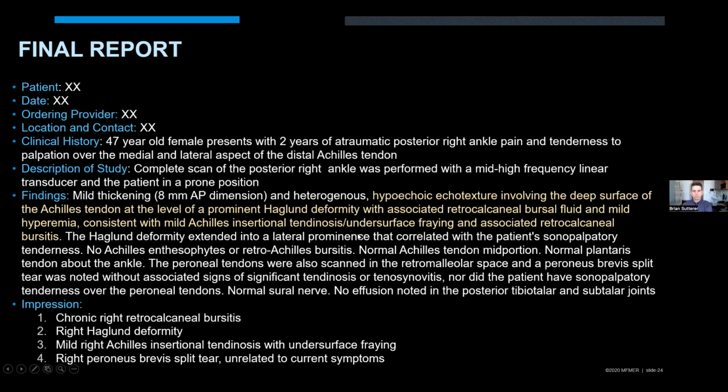And I think you listed it out very clearly, and for those of us that do a lot of it, that information is a stepwise approach to how we can understand what you're saying. Sometimes what I do is say distal Achilles tendinosis as described above. I lay out in the body all those abnormalities, and then I just basically say distal Achilles tendinosis. So that's sometimes how I'll resolve all these little facets to the syndrome here.